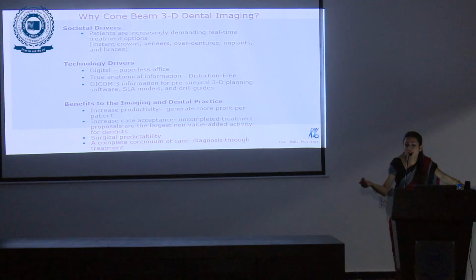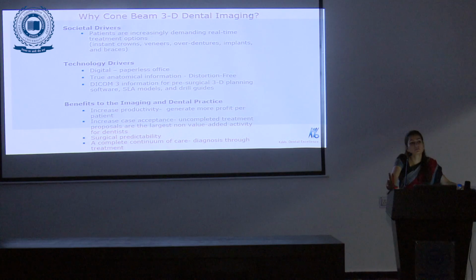When we acquire an image on an analog system that requires washing or developing of the film with the chemicals, and that takes time. Whereas if we have a digital system, it is in seconds. Similarly, our intraoral systems or our OPGs or CBCT machines, they are connected with the machine, with the system, with the PC, and as soon as the scan is complete, it is there on the screen. And then the benefits to the imaging and dental practice.